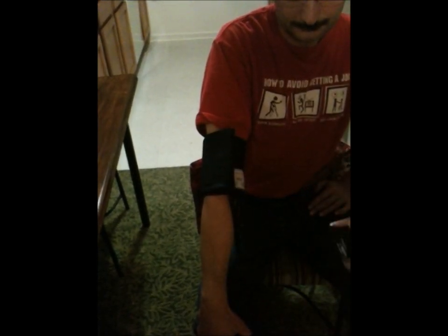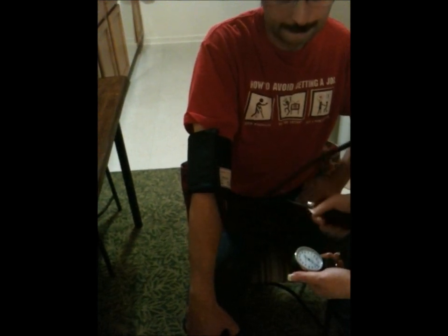You wrap the cuff around the arm and make sure the diaphragm is touching the center part of the arm where you find the pulse. Then take the inflatable bulb, screw it, and start pumping the cuff to at least 200.